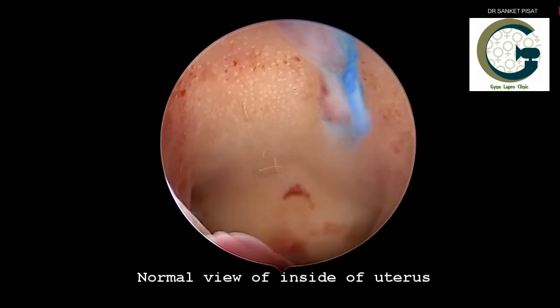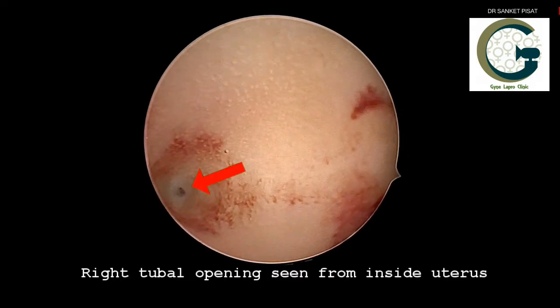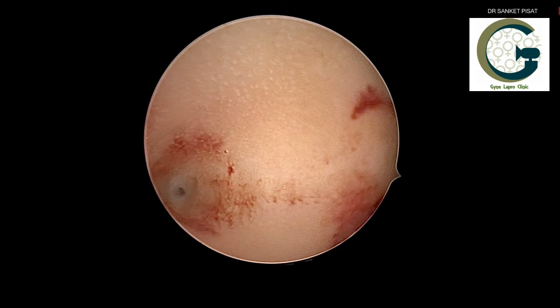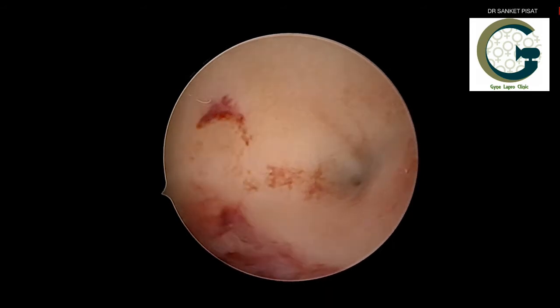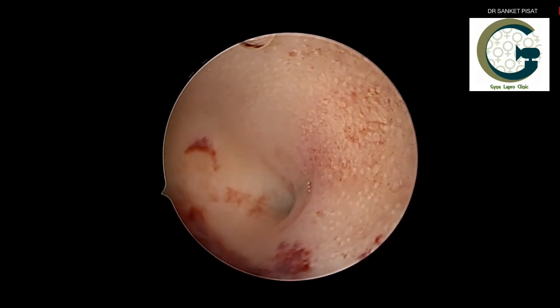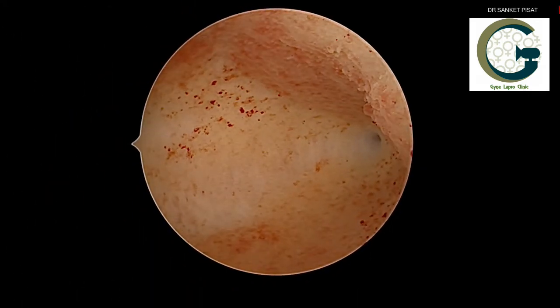This is the normal view of the inside of the uterus, which is a spacious cavity, and you can see the right tubal opening, which is seen from inside the uterus, and a mirror image of this, which is the left tubal opening, also seen from inside the uterus. So the endometrial lining is normally smooth and does not have any localized outgrowths seen.